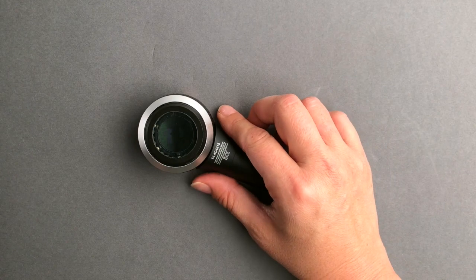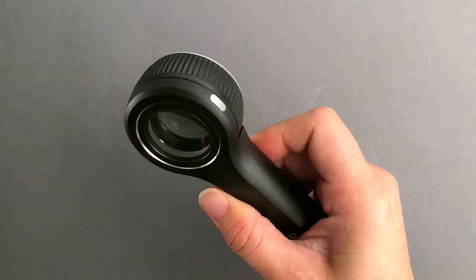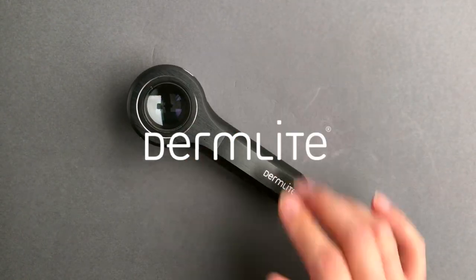Finally, push the power button and make sure that your device is working. And now you know how to replace the DermLite DL4 battery.